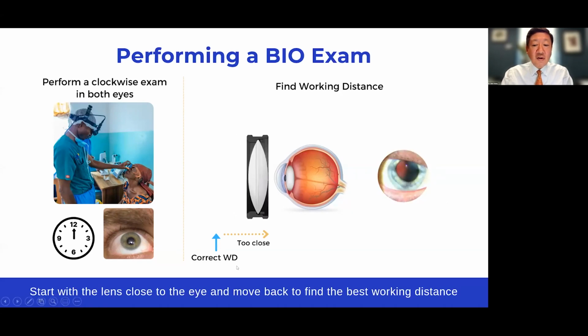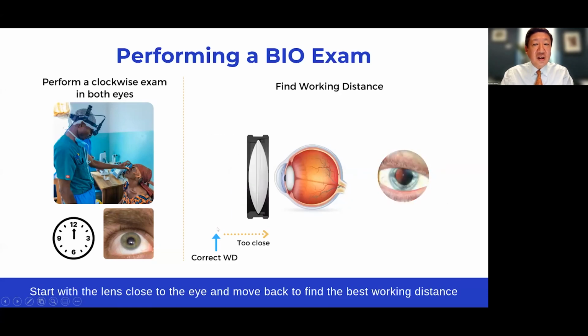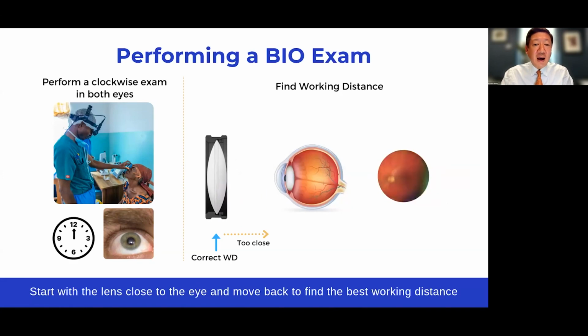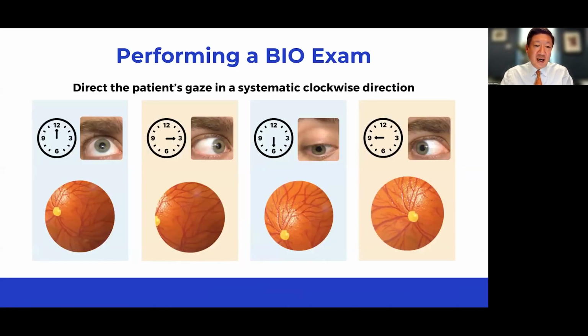So start with the lens close to the eye, move back to find your best working distance. This is something that will become second nature to you. You will automatically find that with practice. But remember to practice perfect exams.